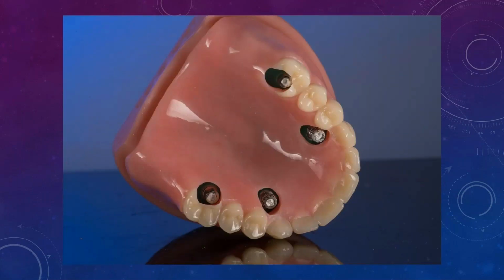But for this, you don't necessarily have to pick up all four. You can just pick up two because all you need is enough information to transfer that onto the model. And a lot of times you're going to have to do a lot of grinding because the tissue areas are still kind of swollen and the prosthesis is not fitting all the way down. So you might have to cut a bunch of areas on the prosthesis.